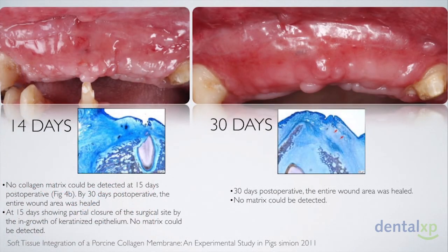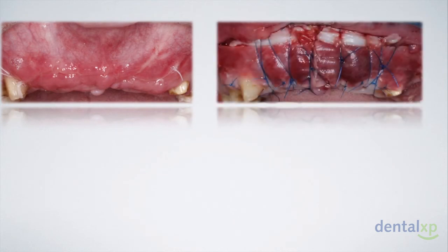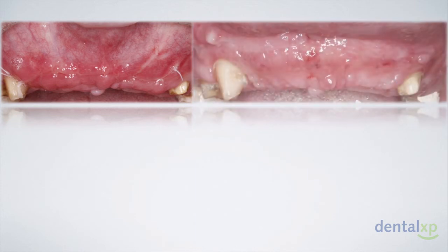And at 2 weeks, again, good tissue integration and blending of the membrane with the surrounding tissue, and at 30 days demonstrating increased vestibular depth with very nice tissue blending, and the patient reported minimal discomfort throughout the healing for this entire case. So as an overall review of the healing, you can see the amount of vestibular increase achieved immediately post-op, and this is the 1-month follow-up revealing maintenance of this vestibular depth and improvement of the tissue quality in the area.